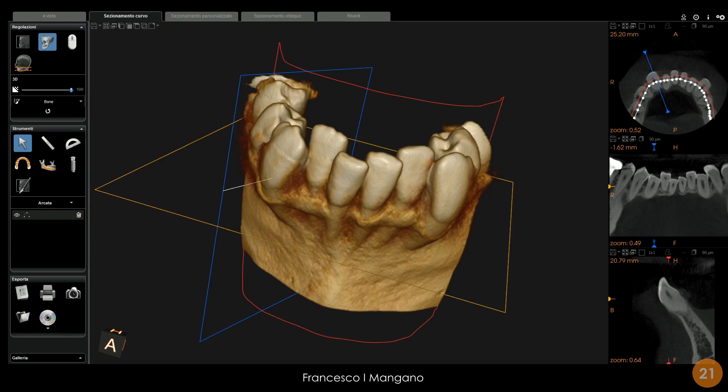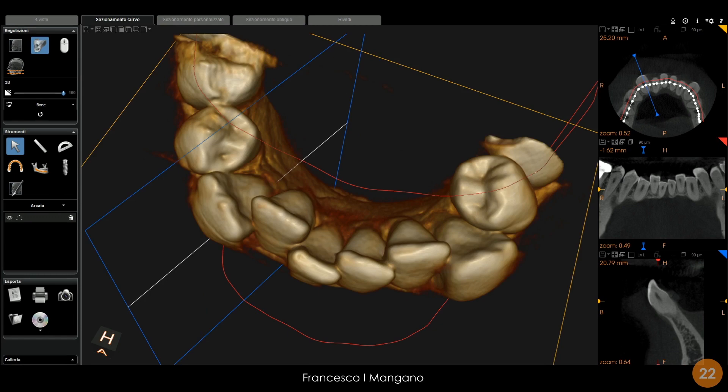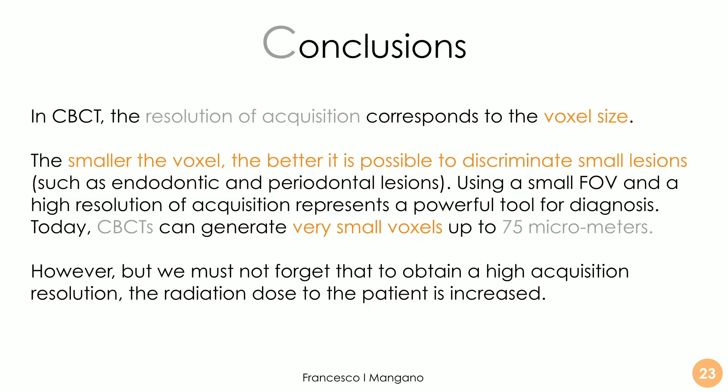The 3D rendering helps us a lot to understand the relationship between the teeth and the bone, where the bone is located, and to identify periodontal problems — in this case, the periodontal lesion. This is very important if we want to plan periodontal treatment or other treatments, gathering all this information. We can rotate the model to have a perfect diagnosis, thanks to the high resolution of acquisition, and also a complete overview of the situation using 3D rendering.